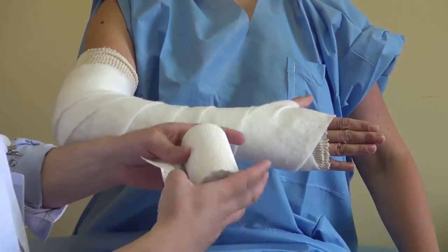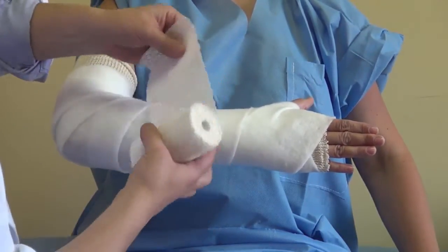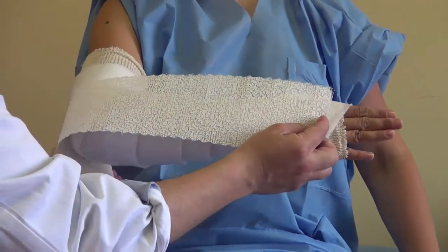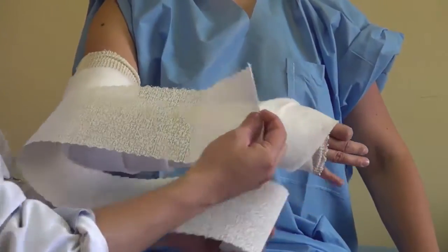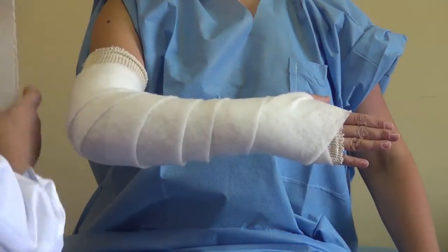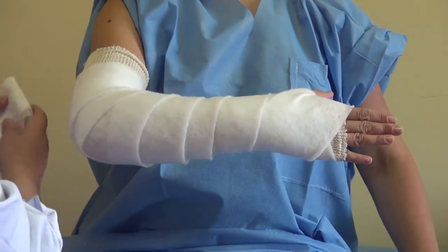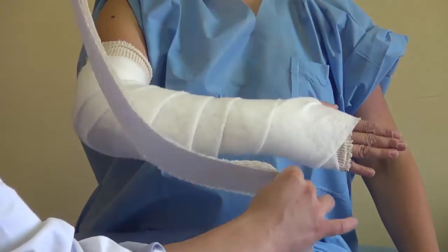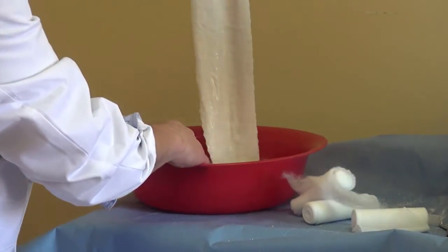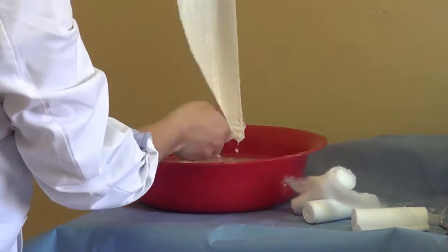Then we take a not-too-big cast to avoid it getting too tight around the arm. We start from the metacarpal area, going around the elbow and back, to get the length that you need — about eight layers of cast to get the right thickness. Then you place it in water and take it out, trying to dry it a little.